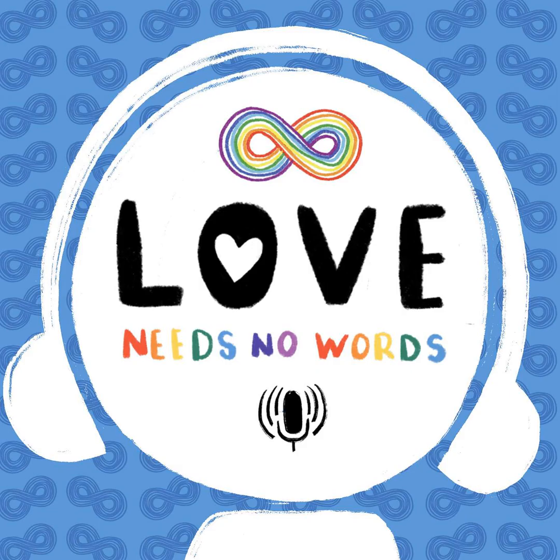And this is the biggest thing that many people think: I'll give them the AAC device, and your instinct is, I'll take this one away to encourage them to look at that one. And actually, you have to flip it around and say, no, give them at least the same access to screen time as you normally do. And I never have to change that for a family. Families tell me, oh, my child has it all the time. Some families say we restrict it. And I just say, whatever you normally do is fine. Give your child at least the same access as you normally give them, if not a little bit more, so that they trust that you're not taking this away.